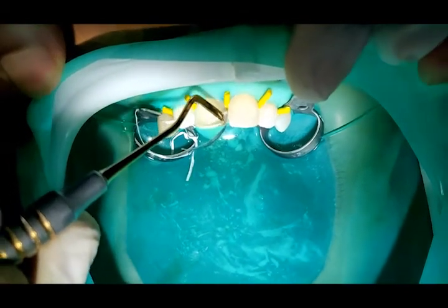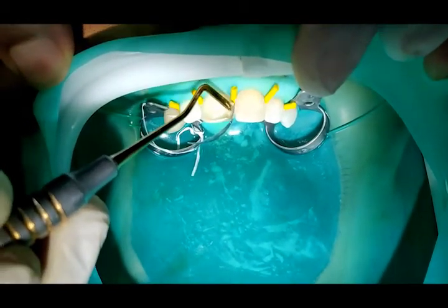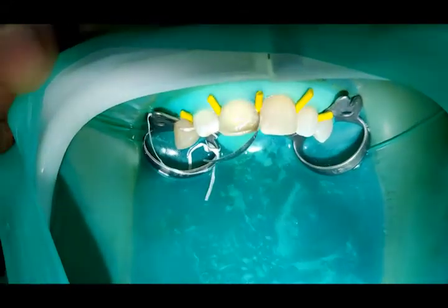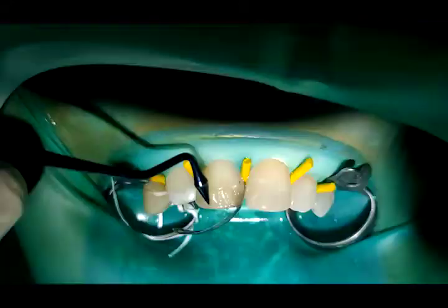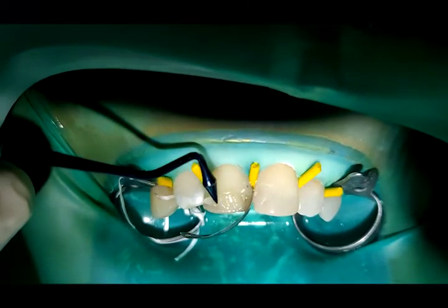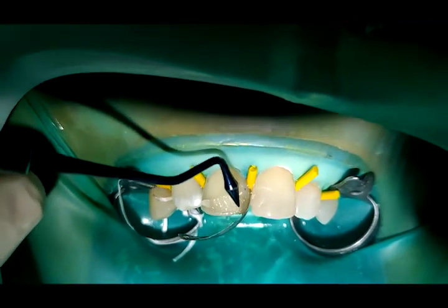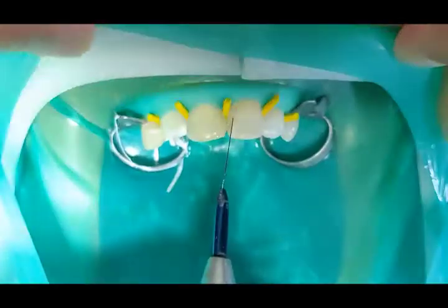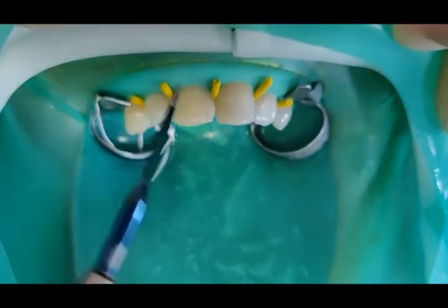Flowable composite is placed first, followed by packable composite for better adaptation. This layer should be thin, not exceeding 0.5 mm. The first dentinal layer is then placed; the tip of the dentine layer should not cover the whole bevel but only a part of it.